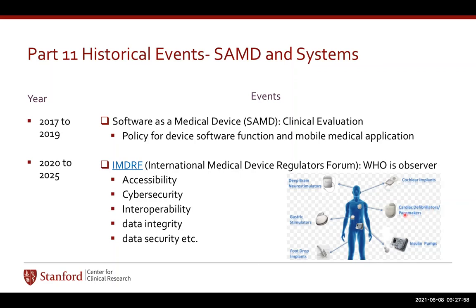And the pacemaker is very, very important here, because Medtronic was making the pacemaker, and then the Department of Homeland Security issued an advisory notice that this is likely to be hacked. And it has been hacked because they were updating the pacemaker using an internet-based healthcare system update. So it was being updated automatically if there was a patch for the particular device. Now, if there is no control on this, and someone else is controlling or has hacked it, the person may die also. The repercussion or stake for this is very, very high.